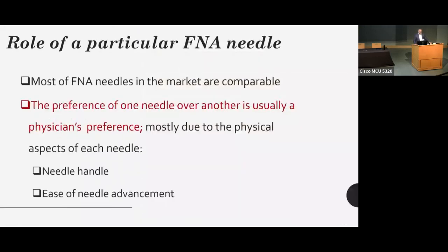So FNA needle. Each and every one of us will have a needle that we prefer. That's how it used to be. Now it's almost like the hospital will dictate a certain needle based on contracts, but we're not going to talk about this. But in a way, the preference of one needle over another, you can ask one doctor, so why do you use this versus that, and he can give you a lot of reasons. At the end of the day, it is a personal preference. It's all about the feel, the needle handle, and the ease of needle advancement, and that's how we get biased into the decision. How did I know that?